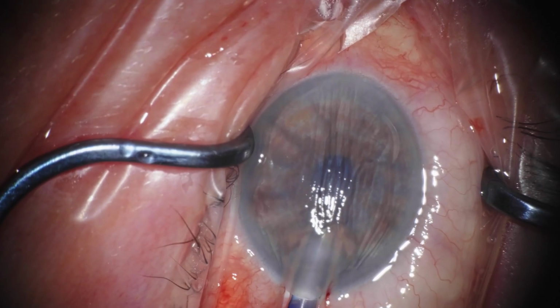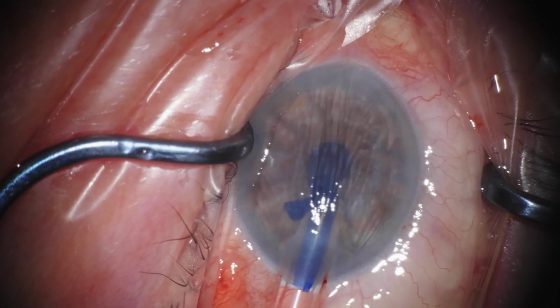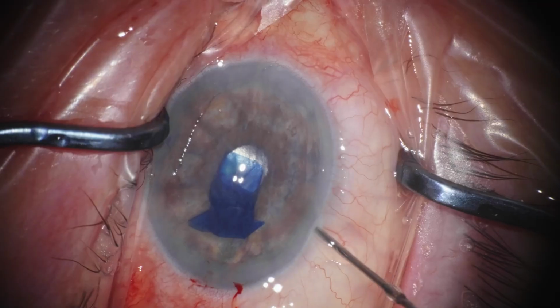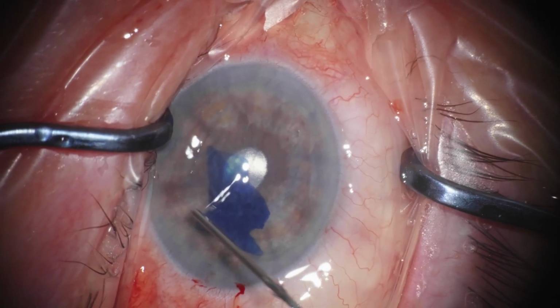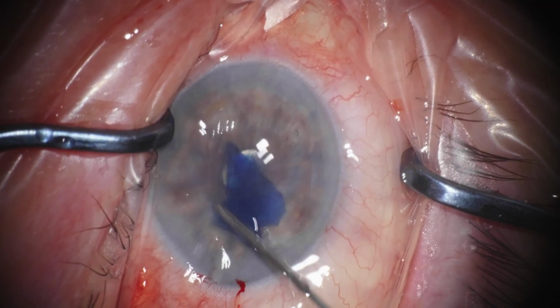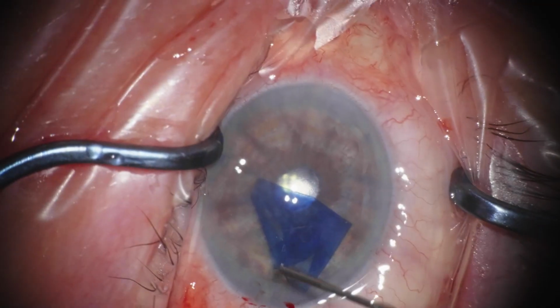This short 2-minute video about a DMEK highlights one of the most important complications that you can have during this kind of surgery. So even from the graft injection, it's visible that the AC is shallow and doesn't want to deepen. There's a lot of posterior pressure.